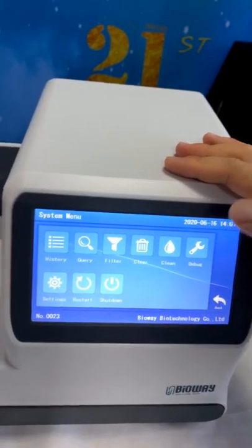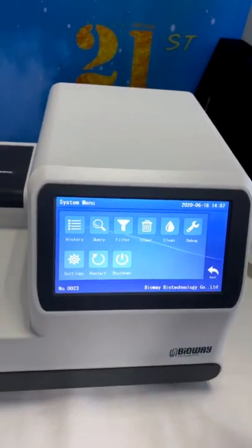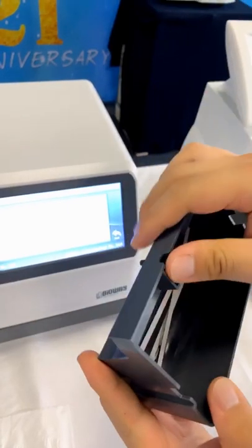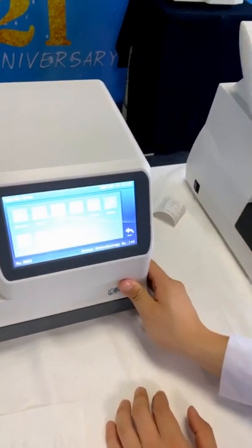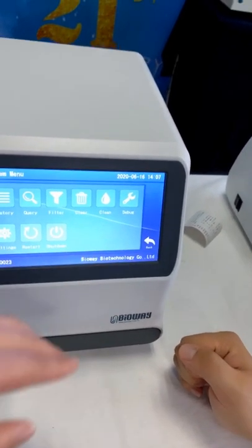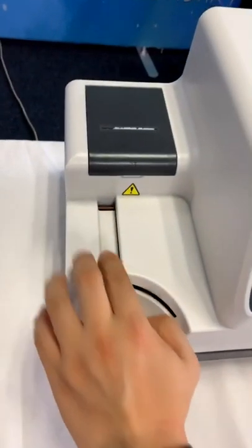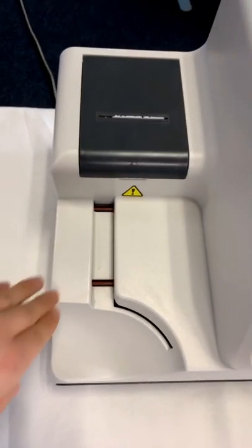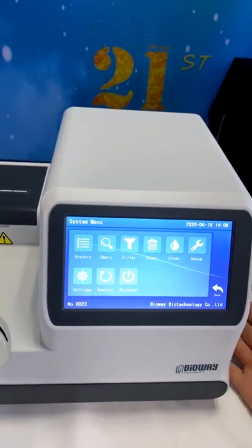And for the debug. You mean the machine can clean it by itself? Yeah, yeah. Usually, in the collection box, we have two slots where we can put in some cleaning cotton and install it, and press this clean function. So you mean before we use this function, we have to install some equipment? Yeah, and these two belts will clean by itself, automatically. Oh, it will move in and be wiped by these two cotton.